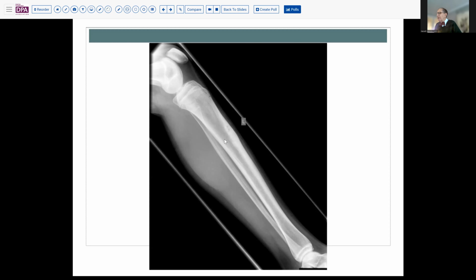But interestingly, this lesion is quite distinctive in some circumstances in terms of its behavior. We don't usually see it in other bones, but it can occur in other bones. It can do strange things, like occur both in the tibia and the fibula at the same time, and so forth. So it's really quite an interesting and distinctive lesion, not usually a life-threatening one, of course.